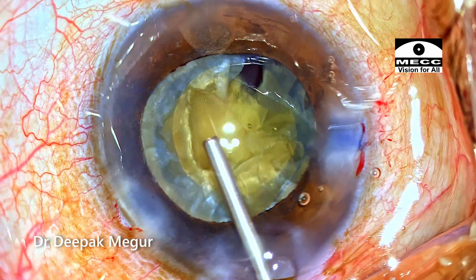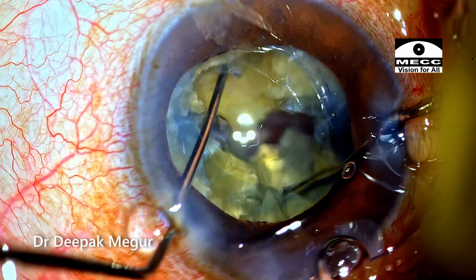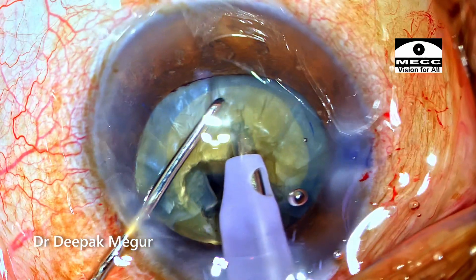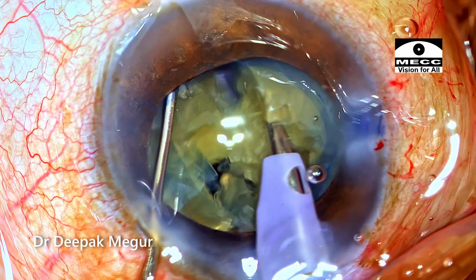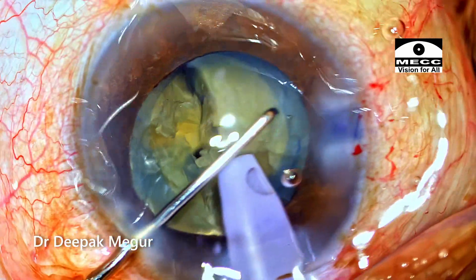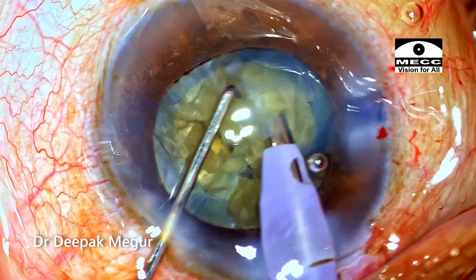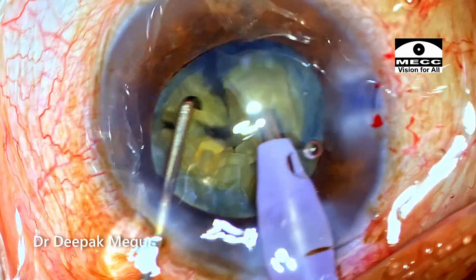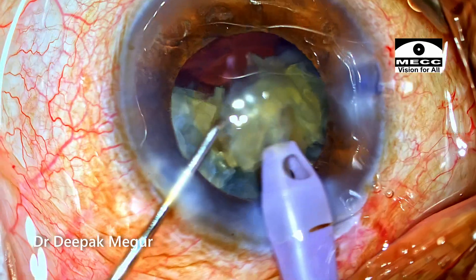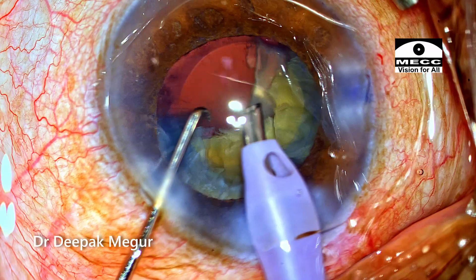OVD is replenished, and it is time to divide the remaining heminucleus. The second heminucleus is divided into three smaller fragments, each of which is then consumed quite easily. I am careful to ensure that the plane of emulsification is at the level of the rhexis margin. Eventually, all nuclear fragments are emulsified safely.